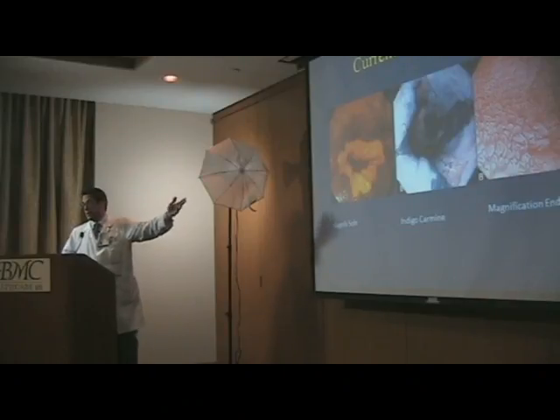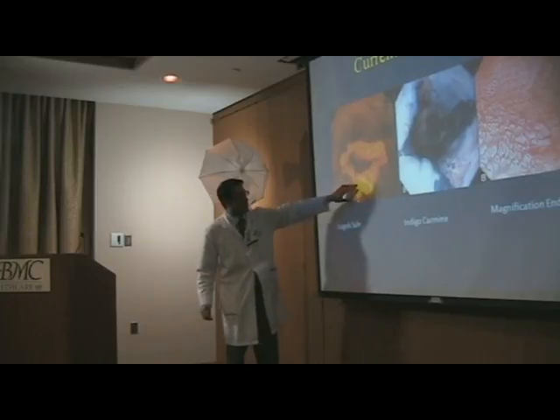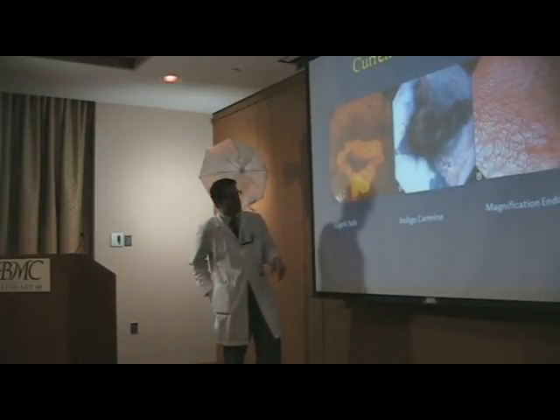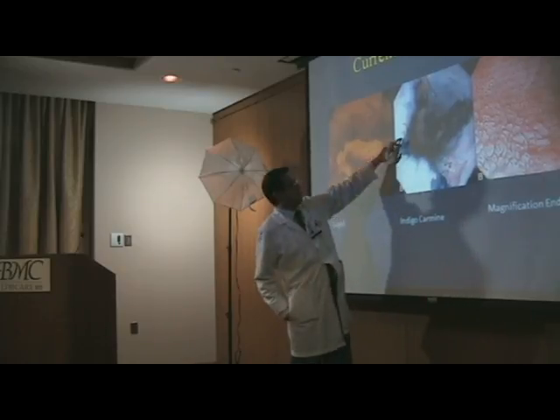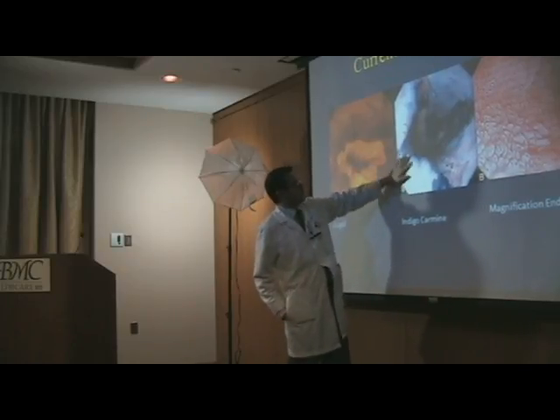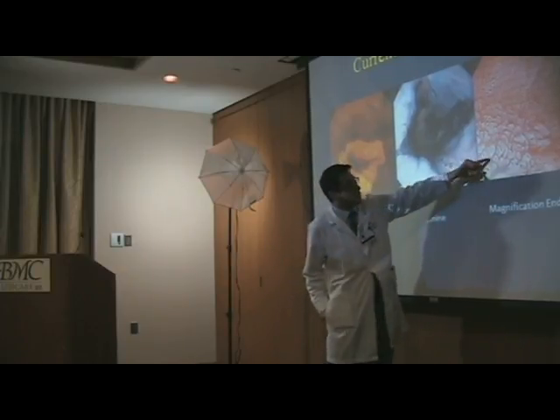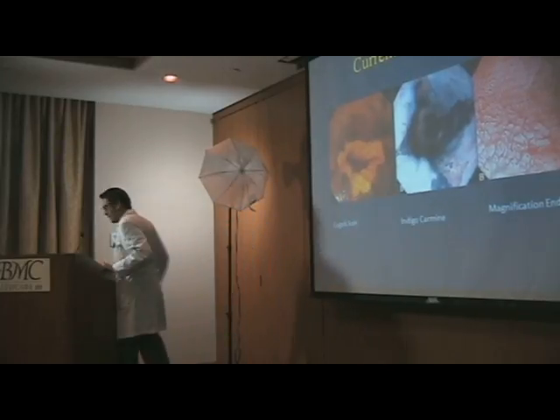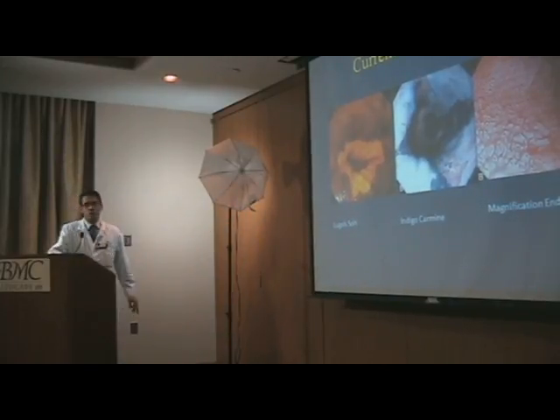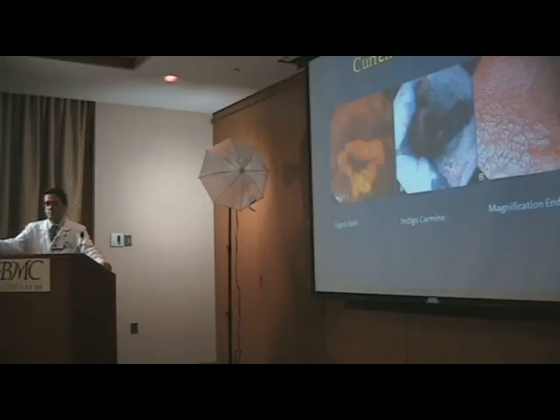Esophagus and where's the stomach. And so you see it beautifully highlighted where this is esophageal tissue, this is gastric tissue. Here's another dye where you can see the segment of Barrett's lit up with this blue dye, and then this is all normal tissue. And then this is magnification, where you can actually see the glands just by pressing a simple button and see the normal versus abnormal tissue. So what we're looking at here is millimeters in size.